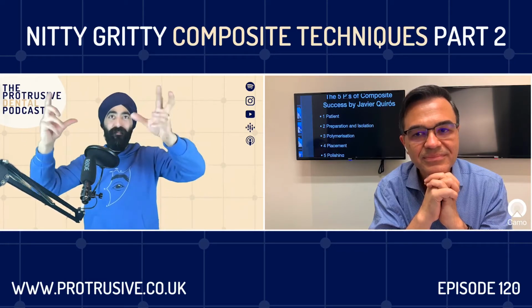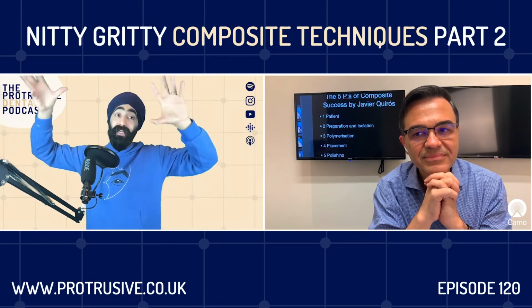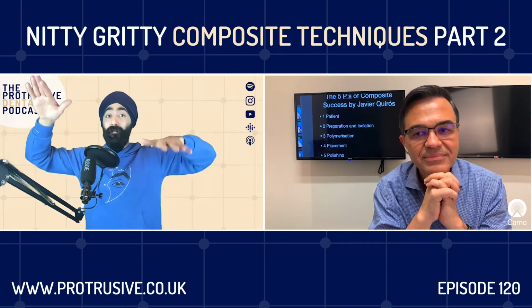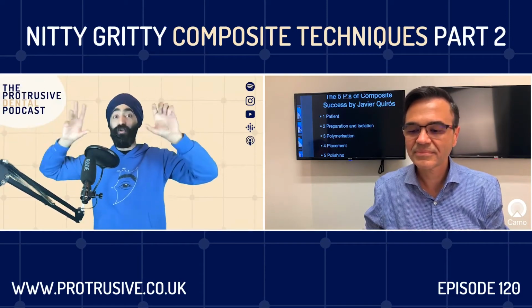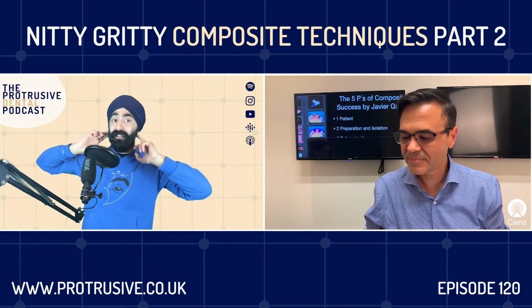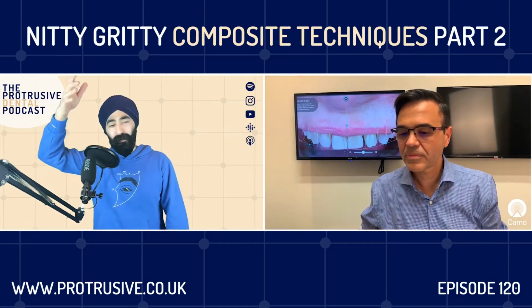So they pretty much have a digital patient, but quite often I will not do a Facebow transfer. I will get the patient in temporaries, and then I'm happy to adjust their temporaries, and then many months later I will convert to ceramic based on using the TMJ as the articulator. But as for your experience of using an actual digital Facebow transfer, please tell me more about that.